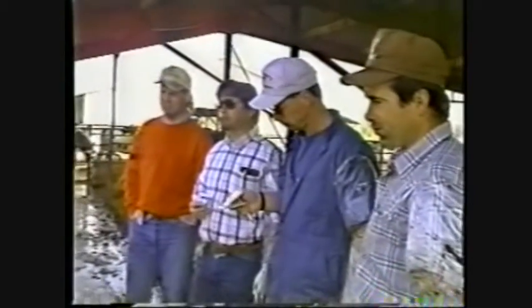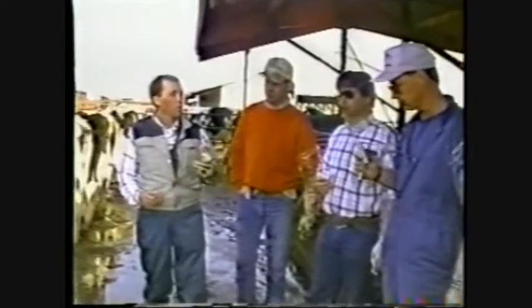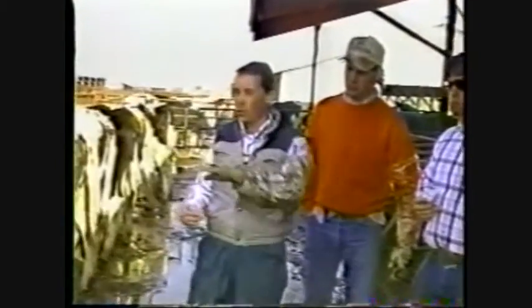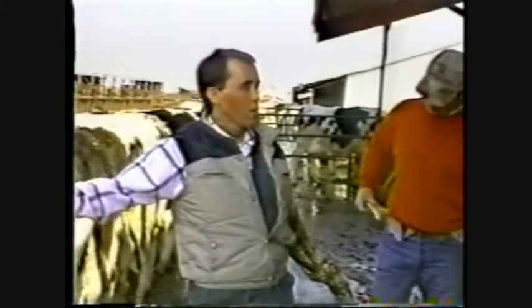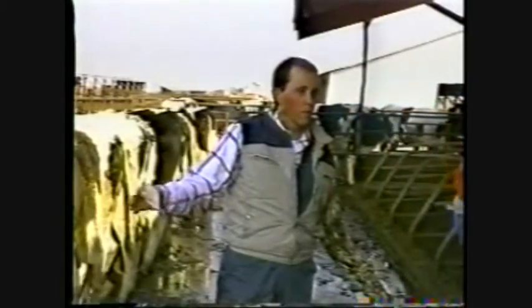You go in here and you find small right, you find a big left about like this, full of fluid. You could probably easily put some pressure on it and the thing would just collapse on down. So yeah. When you look at the chart, we'll assume she was in heat. The paperwork shows someone saw her in heat. She just failed to ovulate and went cystic at that point.